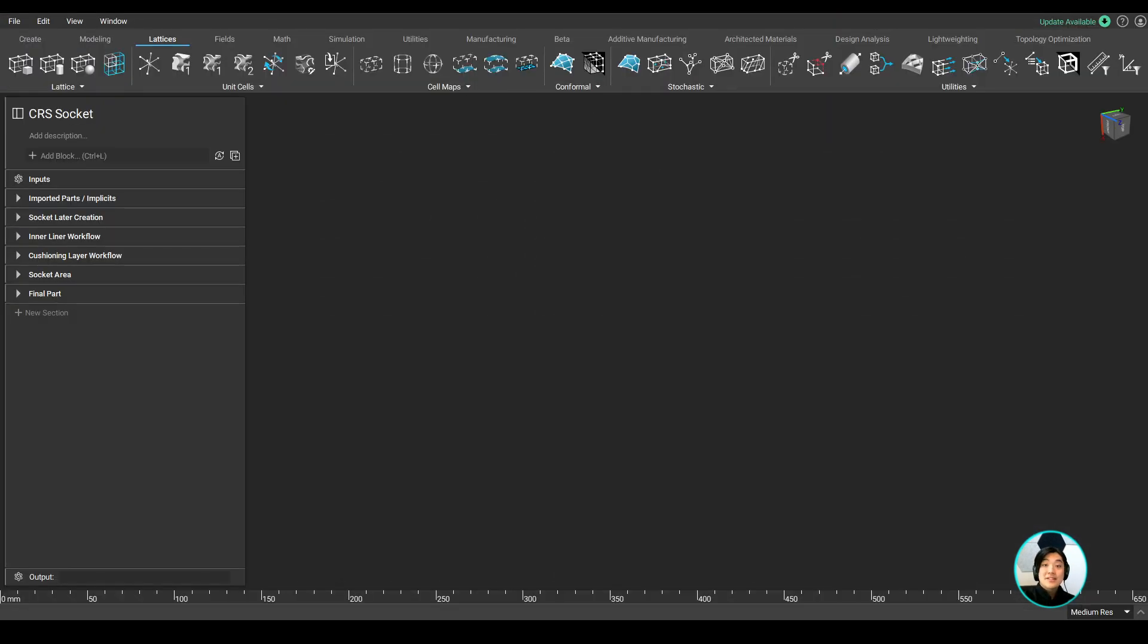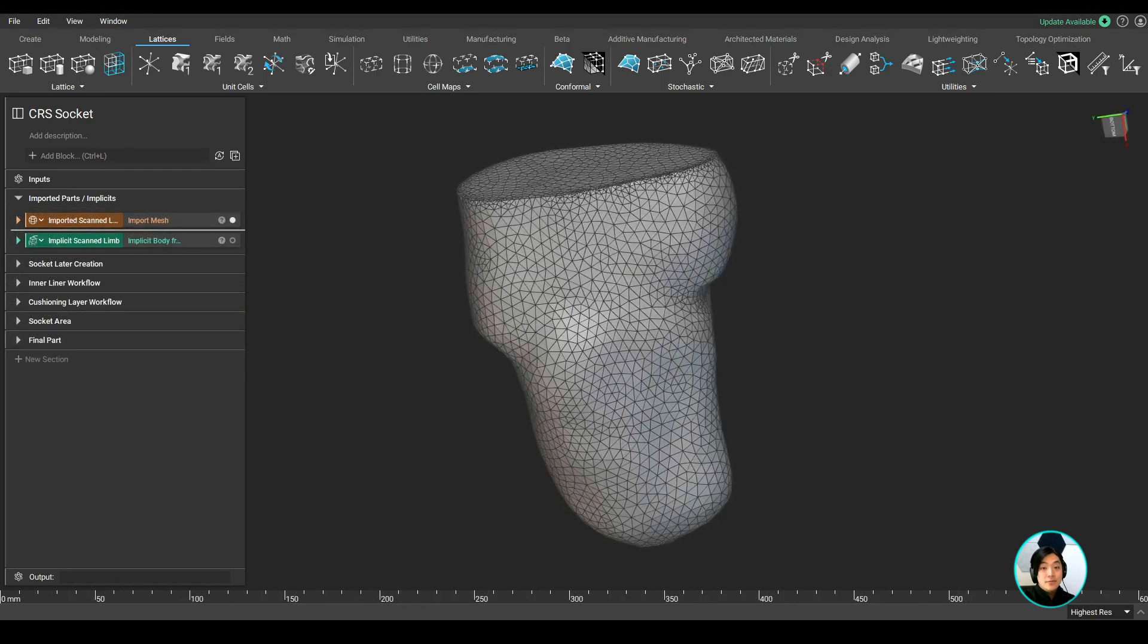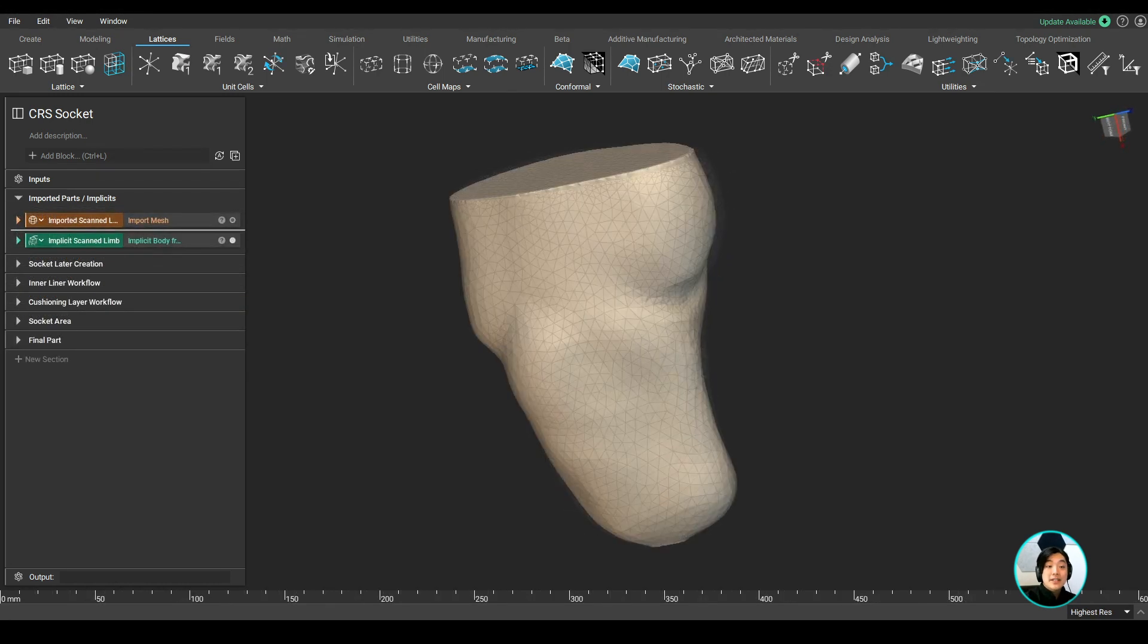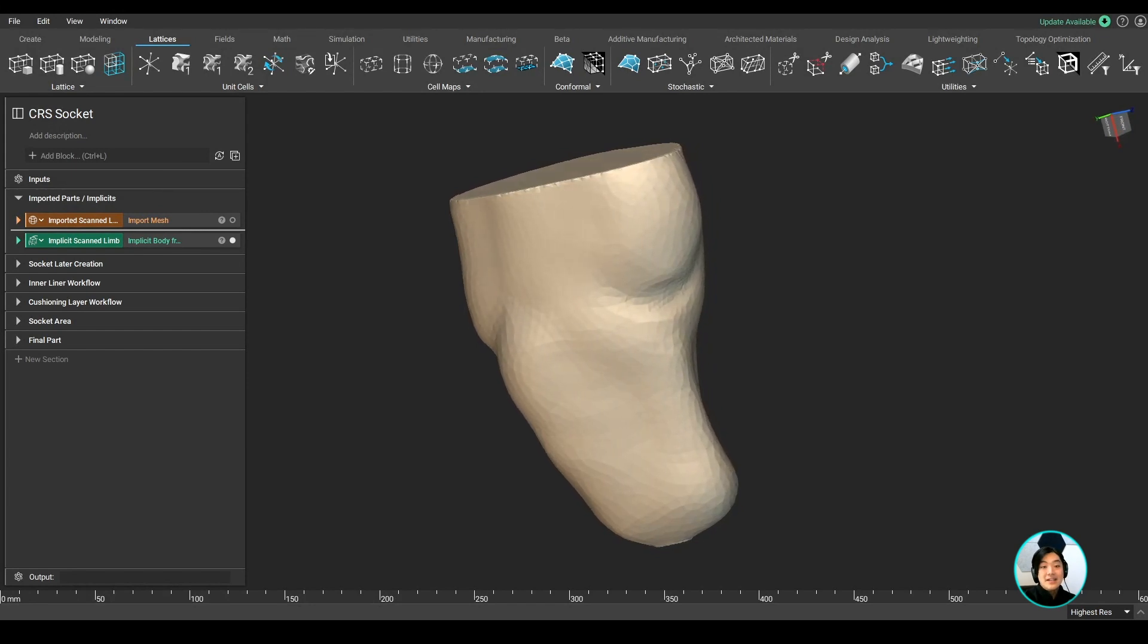To start my mass customization workflow, I imported scanned mesh data of a residual limb. By simply converting it into an implicit, which is nTopology's native format, I can start creating geometry from it.